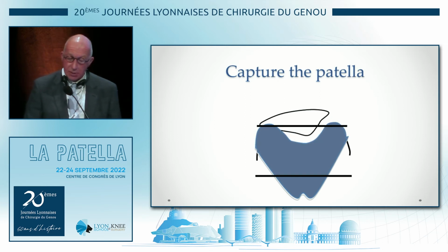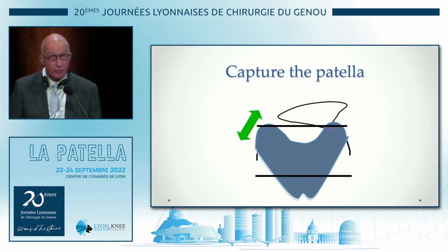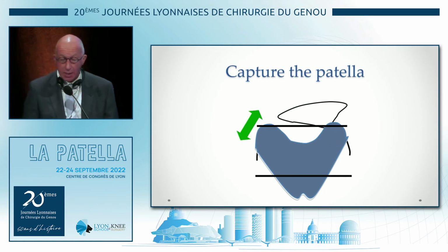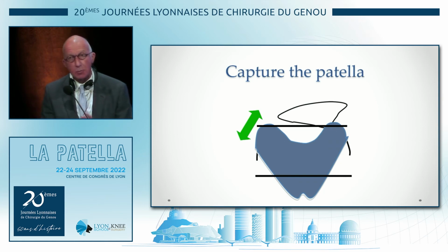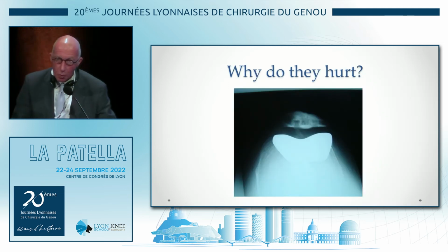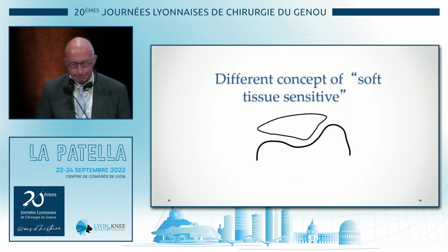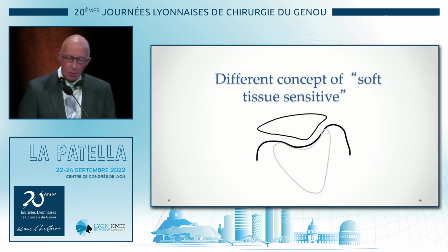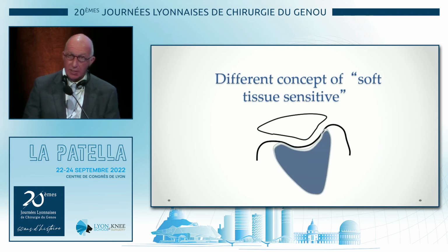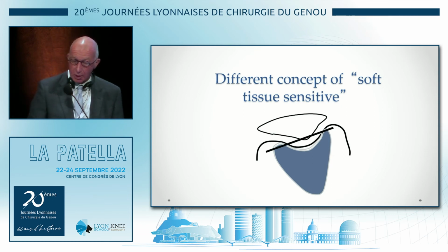And what that means is that your skyline view looks better, but actually you stress the lateral side. So one of the commonest indications for revision of patellofemoral side is pain and clunking. That's because we've tried to push the patella or capture it in an unnatural way. And you can see why that is, because in this perfect skyline view, you can see that there's soft tissue pain.